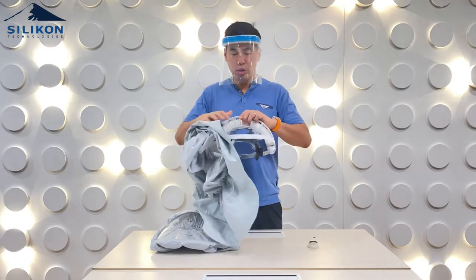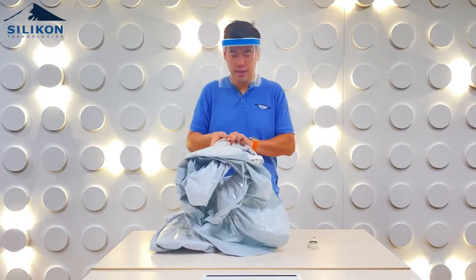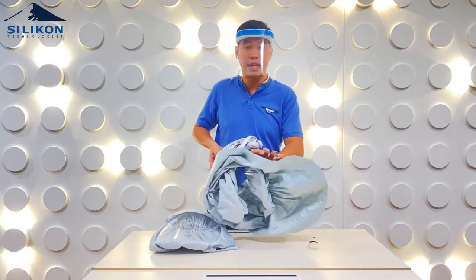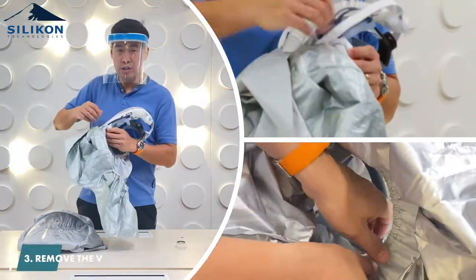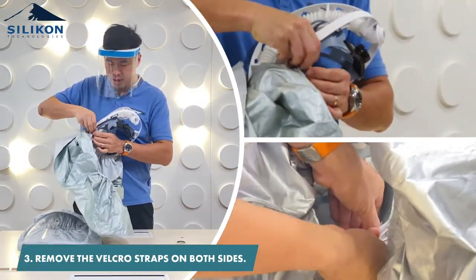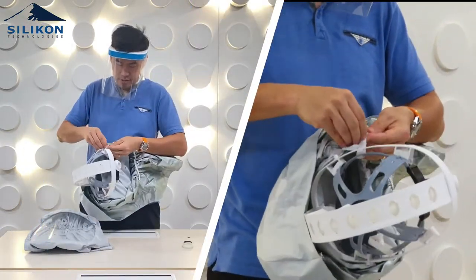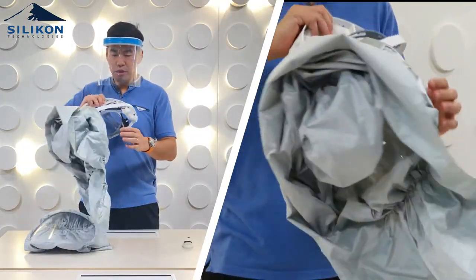The transparent film is connected to the hood frame via three notches. Before that, there's also a velcro strap — if you can see, there's a velcro strap over here. You have to remove the two velcro straps on both sides.